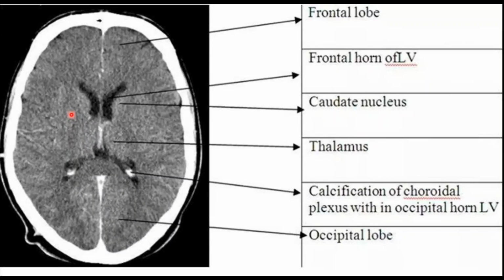So this was a concise and basic study of the CT brain, and I do hope that you would be able to get some information from this video.